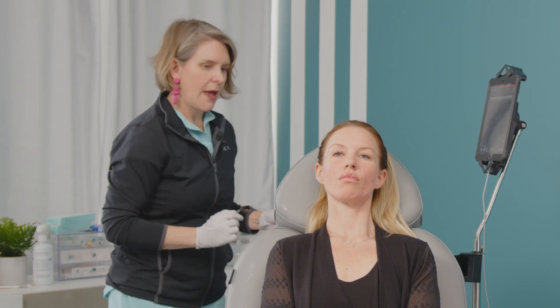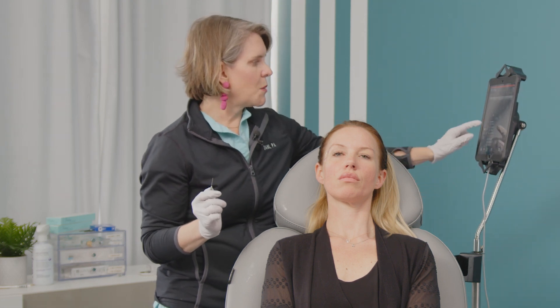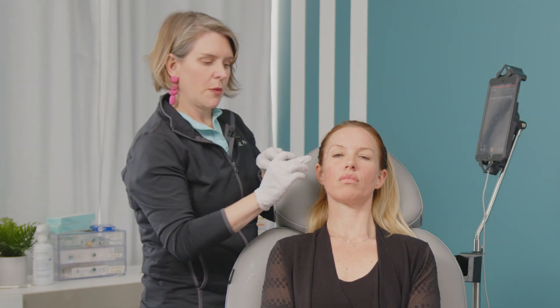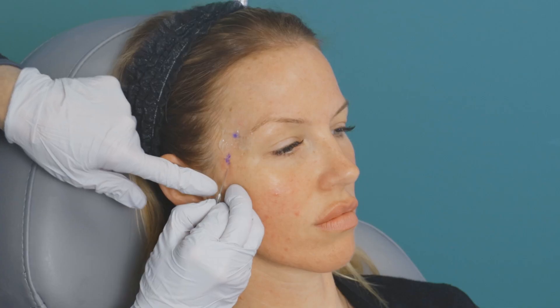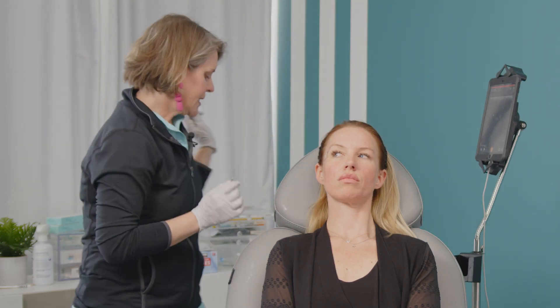After that, we are going to make our cannula site. While I'm waiting for that to numb up, I'm going to go back to B-mode, because when I'm doing ultrasound guided I really want to be in B-mode. I don't need all that drama of power Doppler with a cannula going into it — it'll look crazy. We just want to see that our cannula is in layer two, which is the sub-Q layer right beneath the skin. I'm going to make my tiny little introducer site. All you need to do is make a tiny little poke.